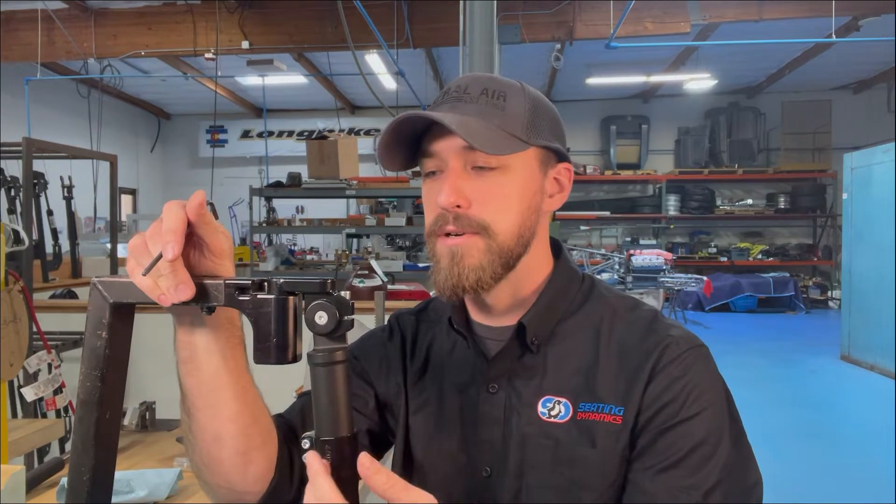In this video I'm going to show you how to change the angle of your dynamic telescoping footrest. This doesn't have the elevation component, so you have a fixed angle at the knee.